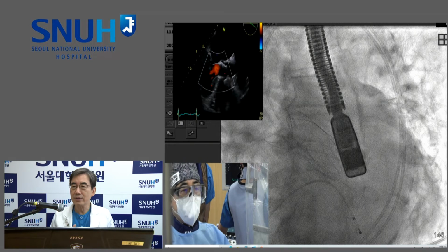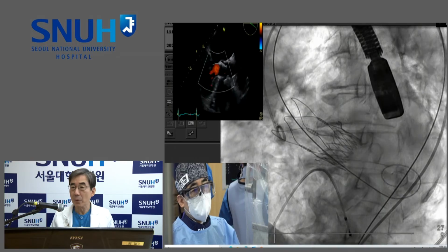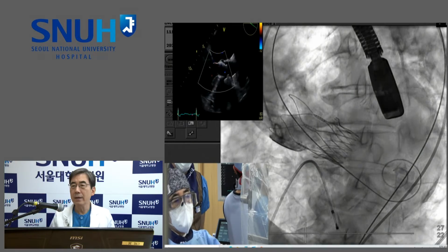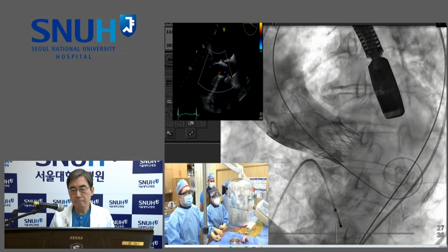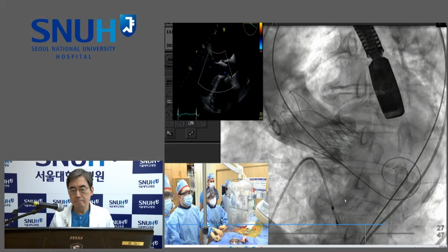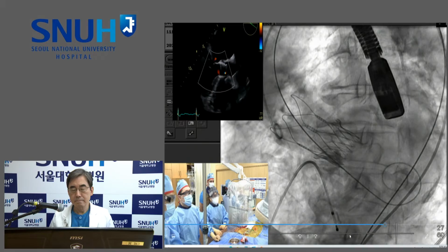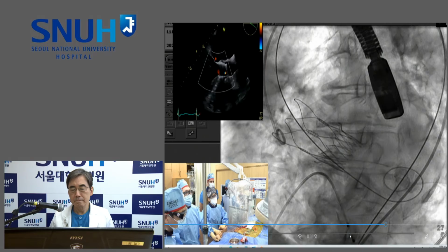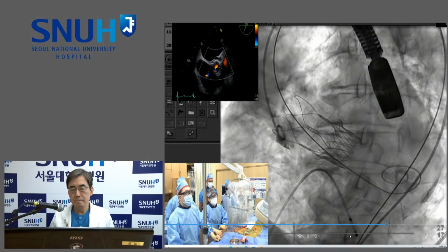Thus, the indication for Accurate may be the widest, except for very severe cases, very heavy calcification, very ugly anatomy. But the procedure looks very simple and very quick. Yeah, I mean, every case I've ever seen with this device, you go, well, that was easy. That's what they all look like. They do seem very quick, and perhaps the cases are well selected, but the results have always looked like this too. So it seems like it's going to be a very good competitor for the other valve systems.